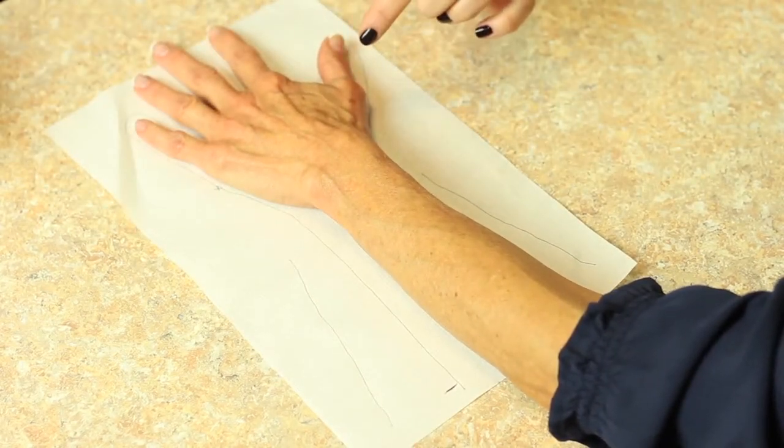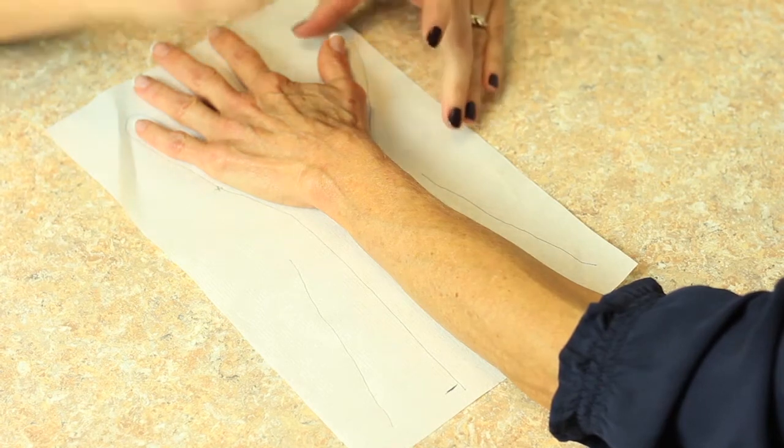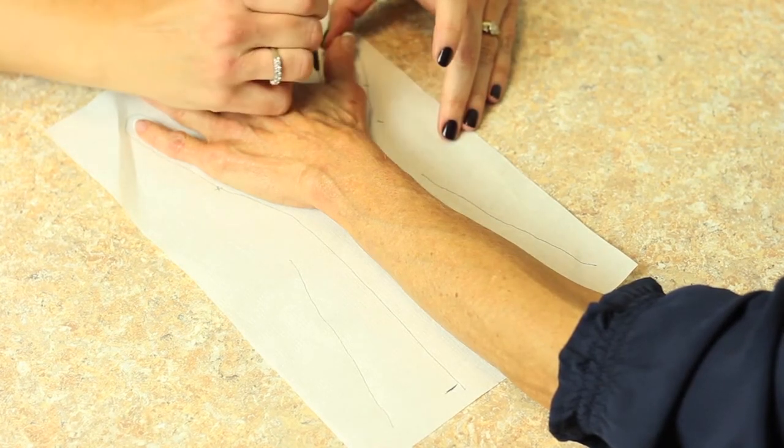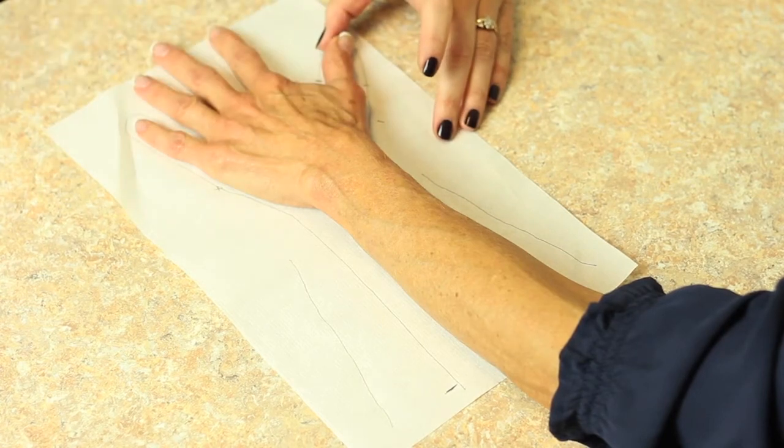To obtain where you're going to put the distal hole for the thumb what I'm going to do is mark for the MP joint of the thumb and the IP joint of the thumb.